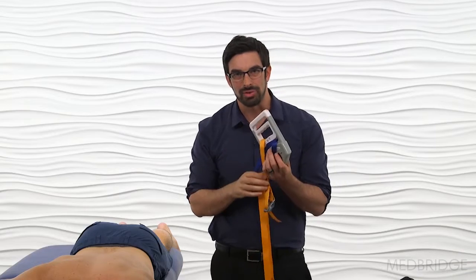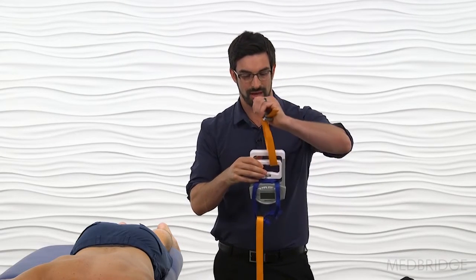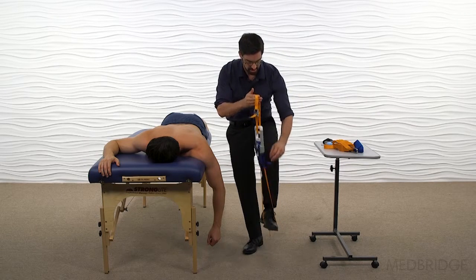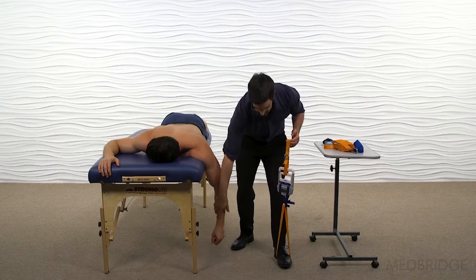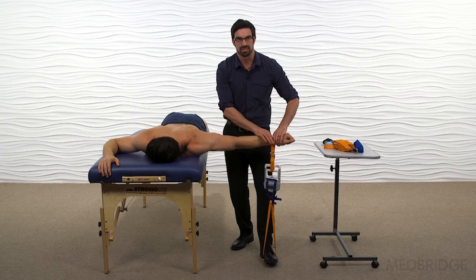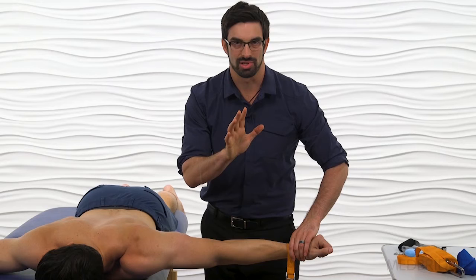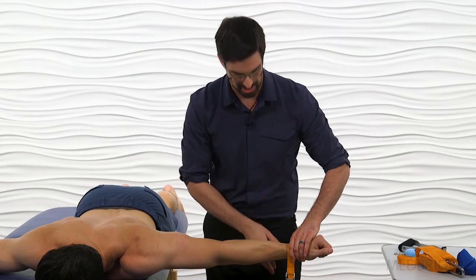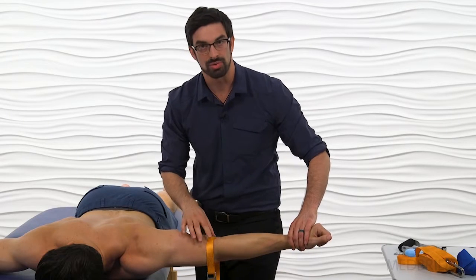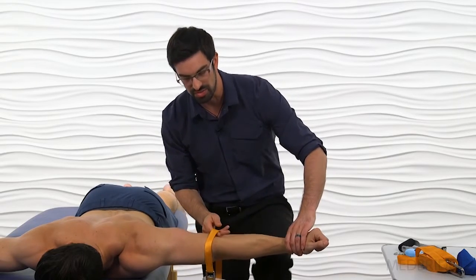Same setup. Using a grip dynamometer, all you do is flip it around — top end up. The patient places their arm through it, you position it on the distal aspect of their radius and ulna, and they can apply pressure and force. If you want a more proximal lever, you can move it backwards toward the distal aspect of the humerus and apply the pressure from there.